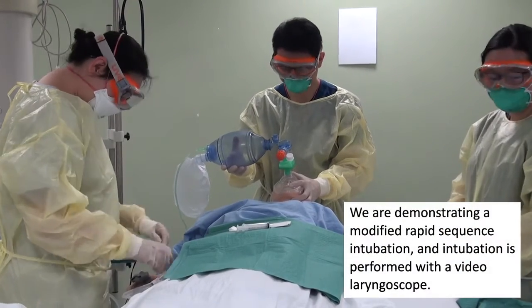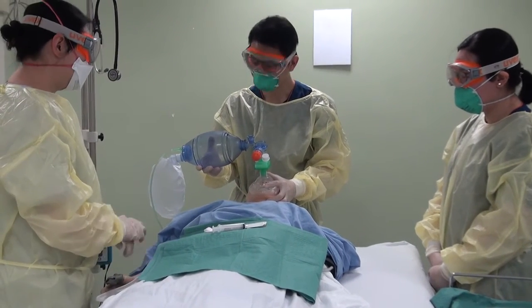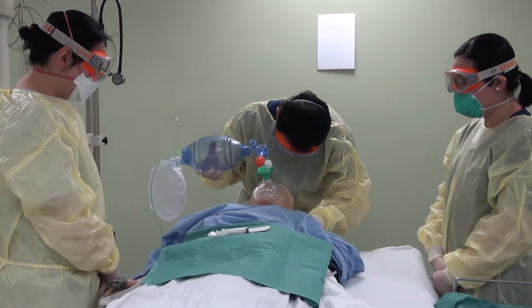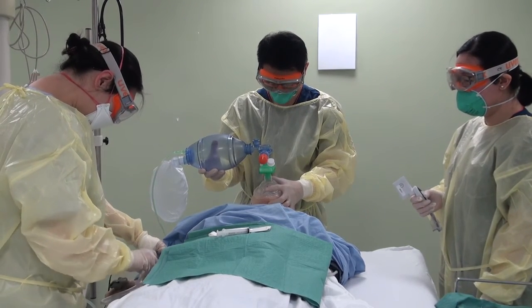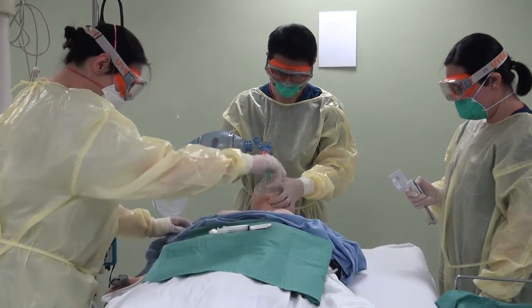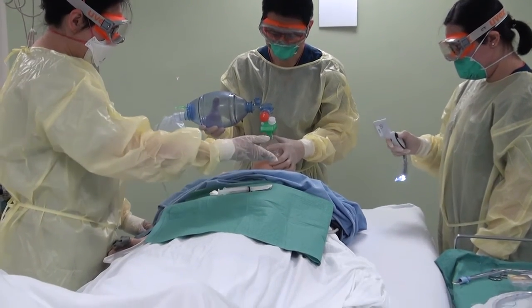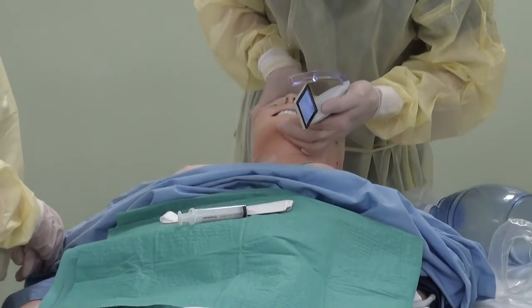When you're ready to intubate, the induction agent can be administered in titrated doses for a modified rapid-sequence intubation technique. It is important during this time for two-way communication so that every team member knows exactly what dose and time the medication was given. Another team member should monitor vital signs and inform the team if there are any significant changes. If the patient is adequately sedated, the paralytic agent is then administered. If a nasal prong is used for apneic oxygenation, ensure that the flow of 15 liters per minute is provided. Avoid manual ventilations if possible. If these are required, provide gentle bag-mask ventilations with a good mask seal. Once the patient is adequately paralyzed, proceed by gently introducing the blade of the laryngoscope, maintaining the midline while it is introduced to avoid trauma to the teeth and oropharyngeal structures.